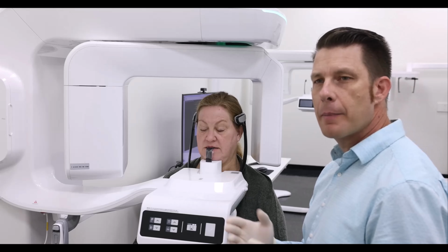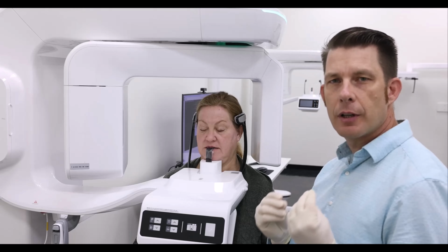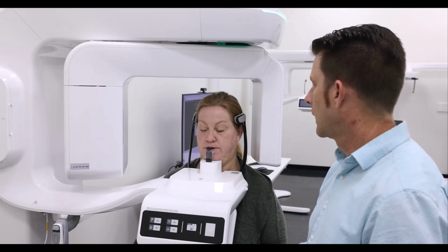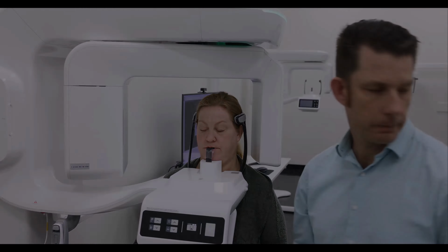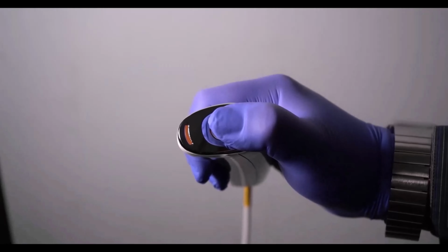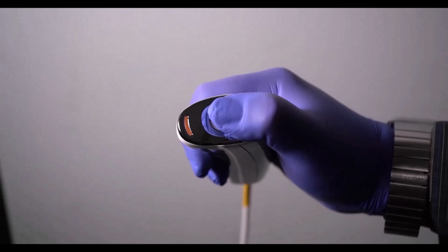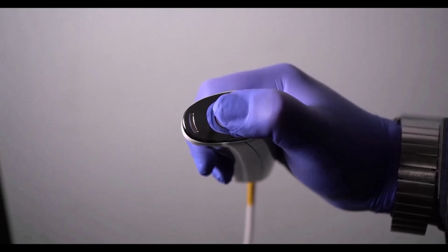The other thing with panoramic capture is I want to have the patient close their lips around the bite stick. Go ahead and swallow and keep the tongue flat to the roof of the mouth. Hold that position. We're going to go ahead and step out of the room and take our image. Hold the button on the acquisition trigger switch, which will turn yellow when exposing. Hold the button until the image acquisition is fully complete.